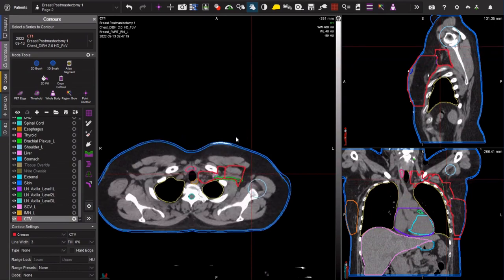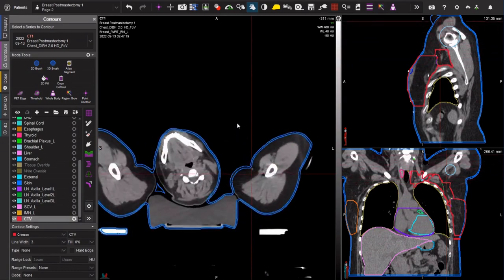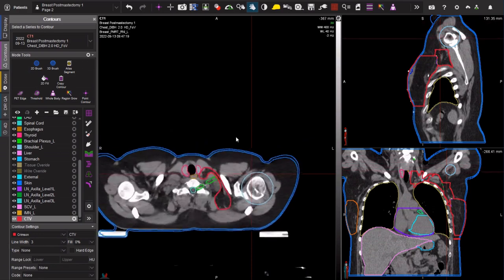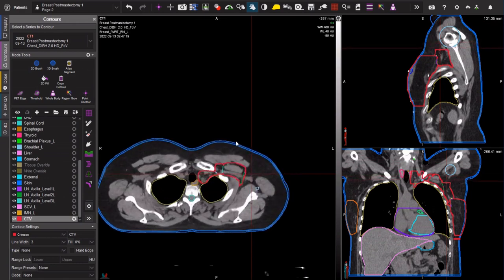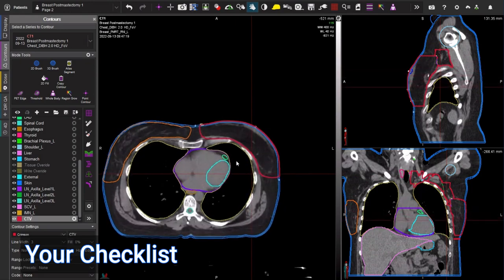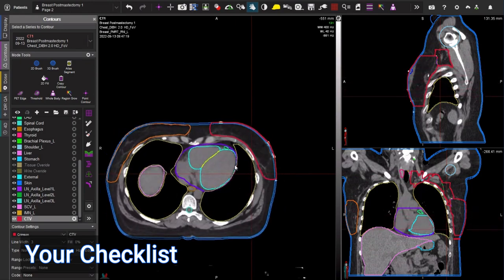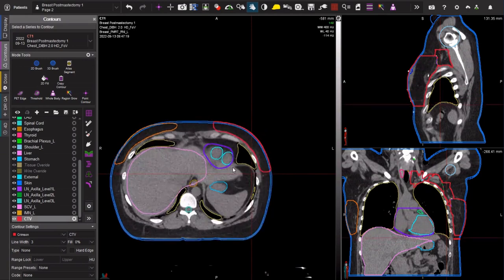Before I start from scratch, I want to show you what a final version looks like. This has all of the main OARs I'd want to include and I'm showing our final CTV in red here. At the end of the day, some things you're going to want to look at: what's the inferior extent of your CTV. So in this case, this patient has a reconstructed breast.